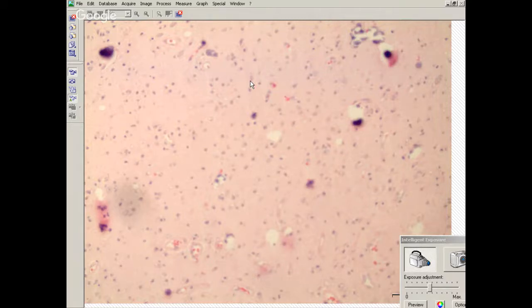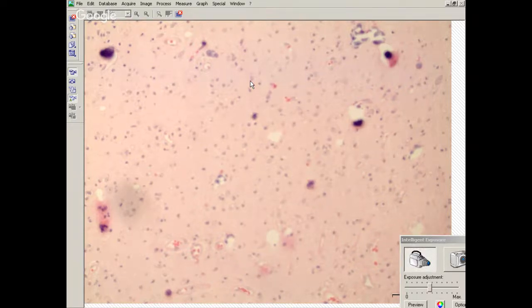Now, there have recently been some changes in oligodendrogliomas and glial tumors in general as far as their grading and diagnoses. So with an oligodendroglioma, is it necessary to have 1p19q codeletion for a diagnosis? Yes, that's true. So now the diagnosis of an oligodendroglioma requires 1p19q codeletion. What about IDH1? So IDH1 is now a marker for low-grade versus high-grade tumors.